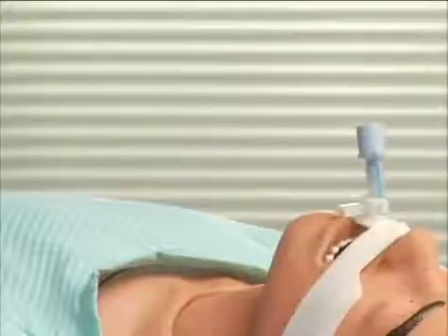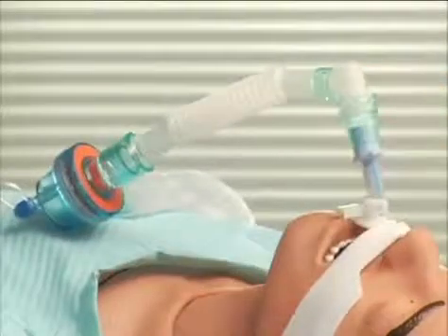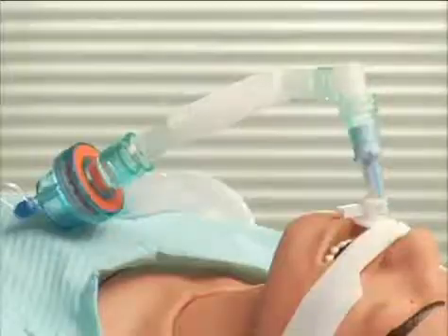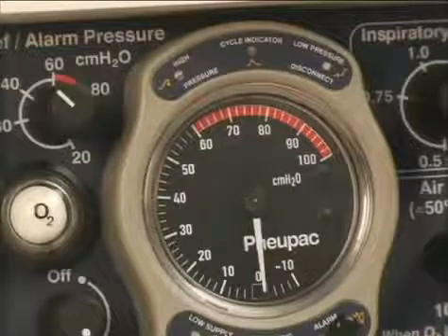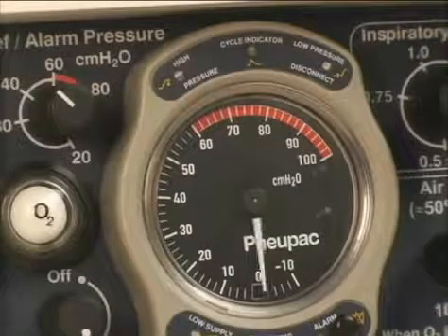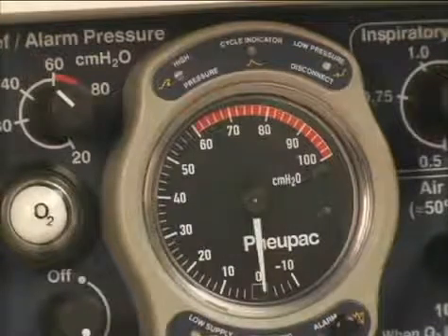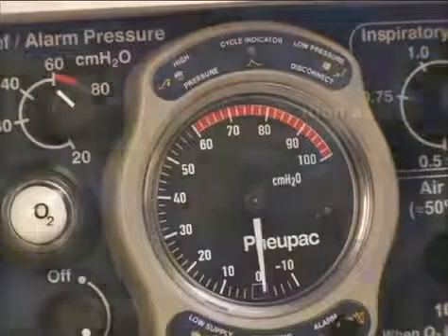When connecting the circuit to the patient, check to be sure the airway is free and apply either a face mask or connect the patient valve to an endotracheal tube. Check patient chest movement and the inflation pressure manometer to ensure correct ventilation. Confirm that the green cycle indicator light flashes during each inflation as the pressure rises through 10 centimeters of water pressure. Make adjustments as necessary.